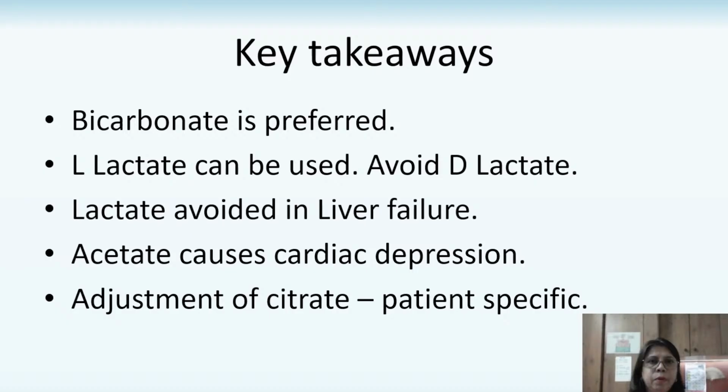Lactate also should be used with caution in patients with liver failure or very severe tissue hypoperfusion. Acetate is usually not used or not recommended because it causes cardiac depression. And finally, citrate can be used both as an anticoagulant and a buffer, and clinical judgment should be used according to the patient characteristics about when to use citrate as a buffer.